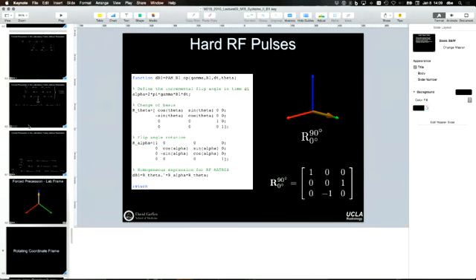Oh, you know what I think it is? It's that the polarization goes from the X direction to the transverse. So this is the precessional behavior at the Larmor frequency. And that's as a consequence of B0, right? Now, if I add a B1 pulse, I'm tipping my magnetization, and the behavior is it's still precessing, because it's still at B0, but it's going to tip down because of B1.